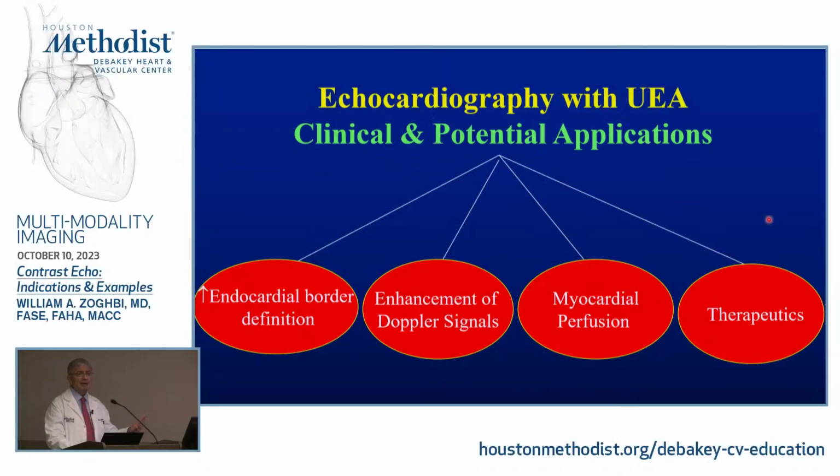So let's go through some applications and some cases so we understand some of these applications. It is FDA approved. These 3 drugs that we talked about are FDA approved. And the one on the left is the major indication that is approved, which is improvement in endocardial border definition.